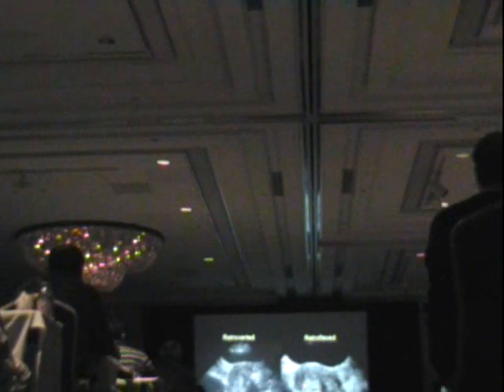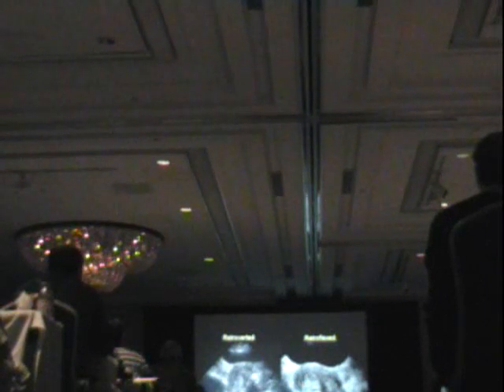Let's not go there. When you look at the uterus transabdominally, there are a couple of different positions that you can see. Sometimes we see a uterus that's retroverted, and in the retroverted uterus, the entire uterus, with the exception of the cervix, is directed posteriorly. In contrast, in the retroflexed uterus, most of the uterus is anterior, and then just the fundus bends. And these you see, these are transabdominal, of course, with a full bladder.